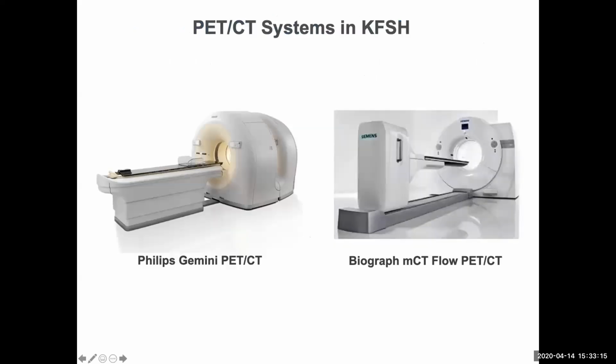These are the two machines we have in King Fahd Specialist Hospital. We have the old one, the Philips Gemini PET-CT, and we have the time-of-flight Biograph mCT Flow PET-CT.